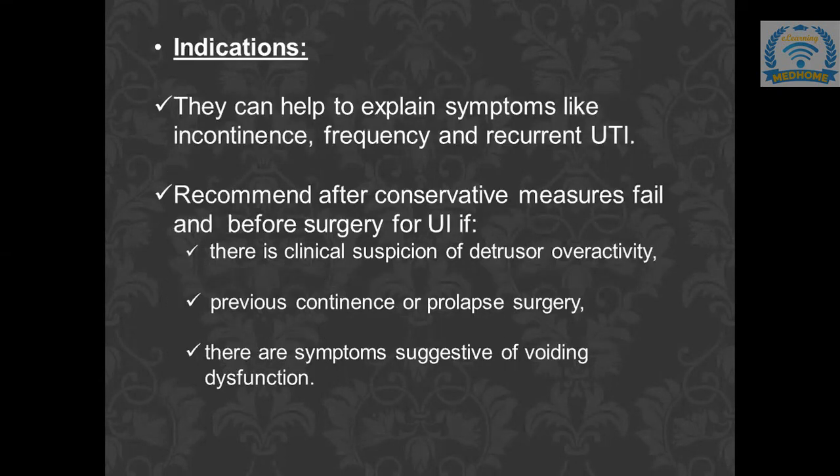Yes, ma'am. Now, why do we do urodynamics? The importance or the indications of urodynamics are that they help us to explain symptoms like incontinence, frequency, and recurrent urinary tract infection. It is also recommended after conservative measures have failed and before surgery for urinary incontinence, if we have a clinical suspicion of detrusor overactivity, or there is previous continence or prolapse surgery, or there are symptoms suggestive of voiding dysfunction.